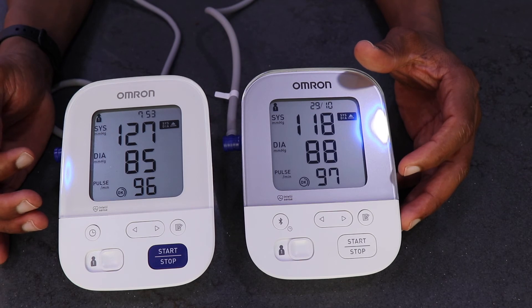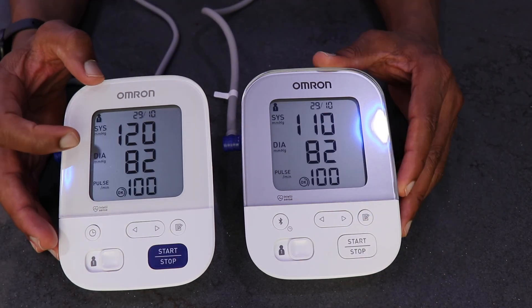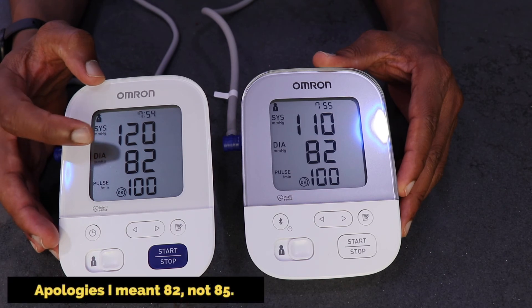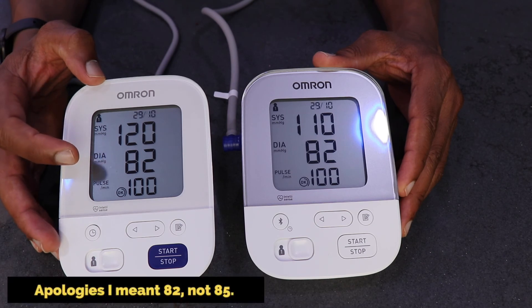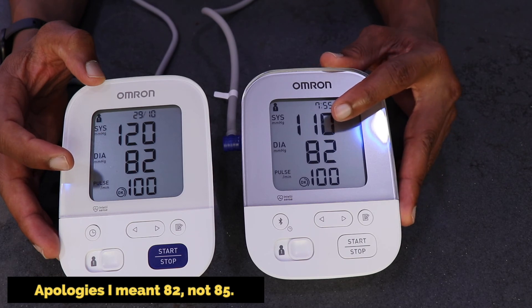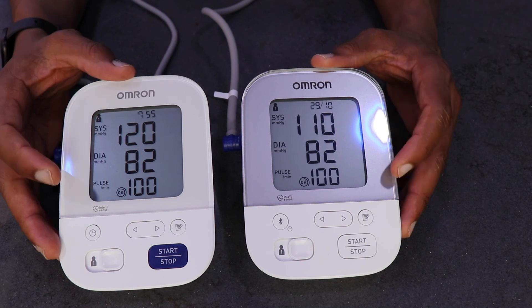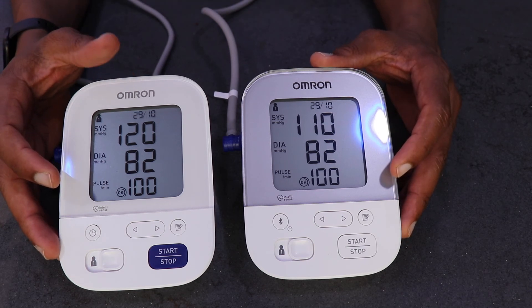Taking another reading: the right hand says 120 over 85 with a pulse of 100, and the left hand side is 110 over 82 with a pulse of 100. The difference again is with the systolic reading.